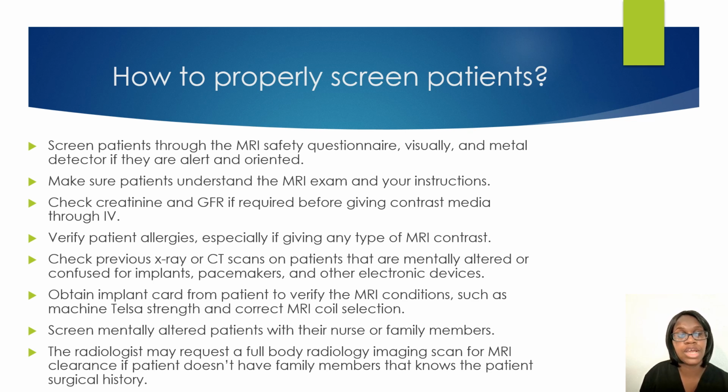Do not be afraid to turn patients away. If they do not have an implant card and they have an implant in their body, you have to think about the patient's safety. Sometimes they do not understand why they are being turned away, and that's because you have to educate them. So do not do the scan. Check with the radiologist, check with the ordering physician, and try to obtain an implant card.